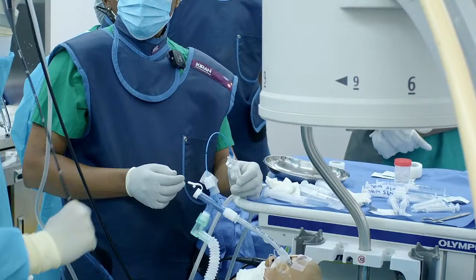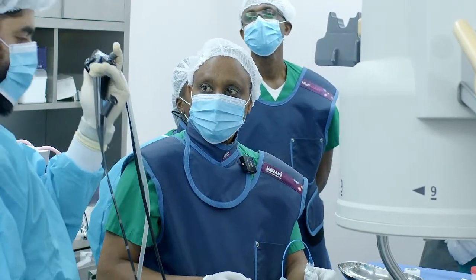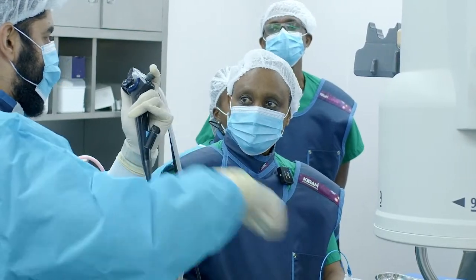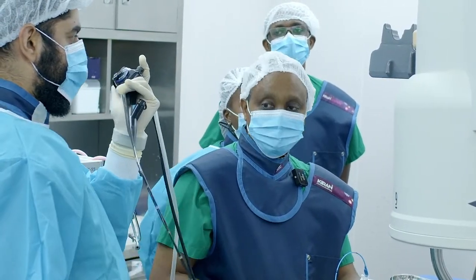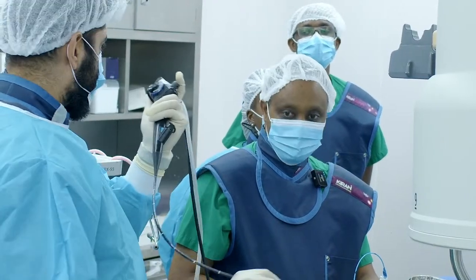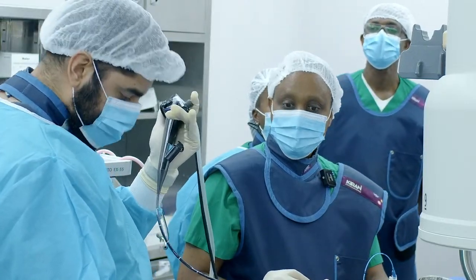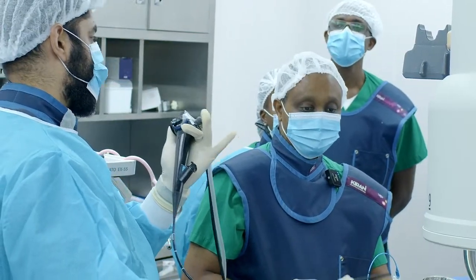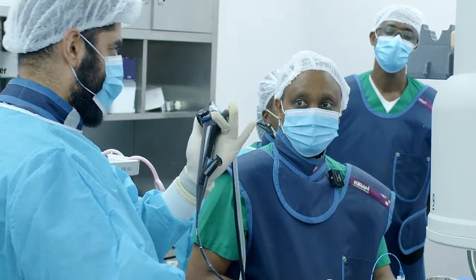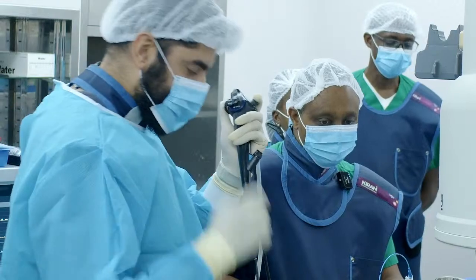What I do is I always grip the probe itself, in these fingers, so that when I pull it out, the probe is not stuck and it's not sliding over the probe. It makes it easier to come out sharply. If, for example, you pull and you find it's stuck, then you release the pedal, wait for it to thaw, maybe 10-15 seconds, come out and try again. That's the general idea.